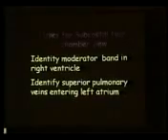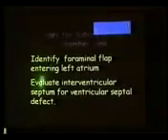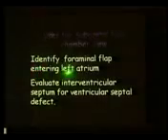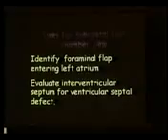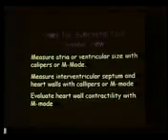It will identify the foramen ovale flap much better, and will evaluate the interventricular septum much better than the apical view. The reason is physics, and we must know that factor very well.